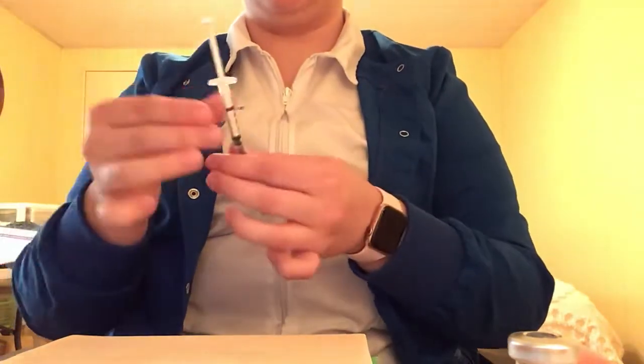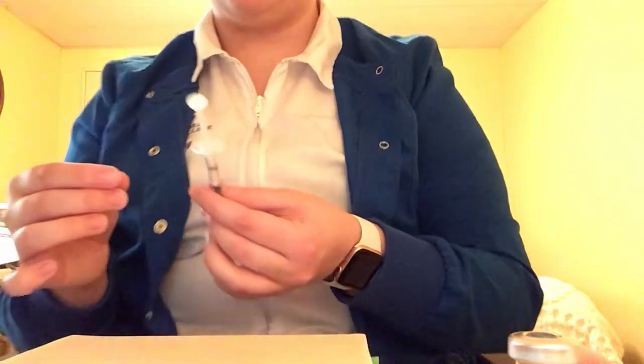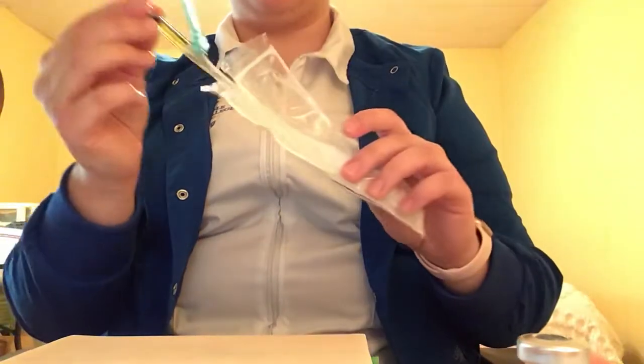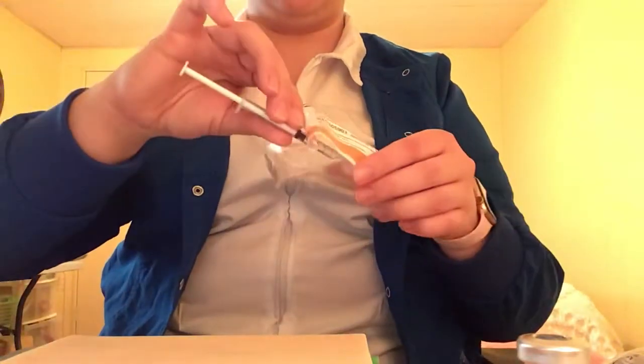And I would also label this syringe with the patient's name, my initials, date and time, and the medication and dose. So this again is the subcutaneous injection, and this one is the intramuscular injection. Now, since I am going to be going back to the patient's room, I'm going to go ahead and put these back in their packages just to bring them with me.